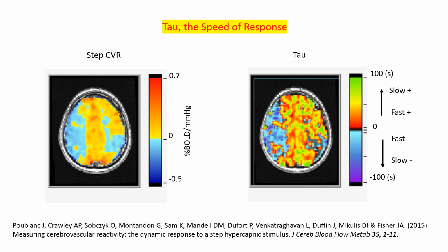Here is an example axial map of tau on the right from the STEP CVR data shown on the left. As the tau map shows, the steal is light blue and fast. Steal by the healthier voxels is immediate in these unresponsive regions of the cerebrovasculature. Even some regions with positive CVR are nevertheless slow, as shown in the tau map's green regions.